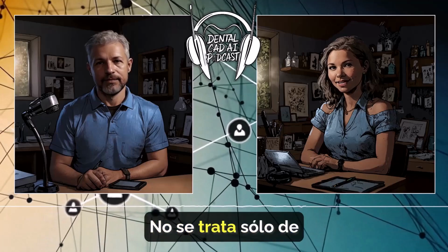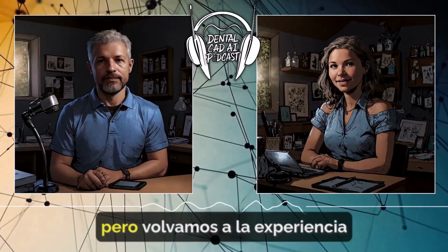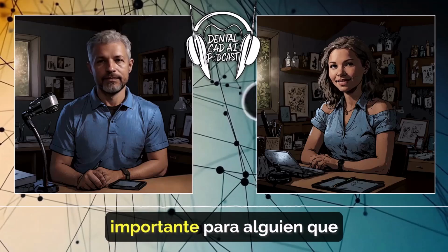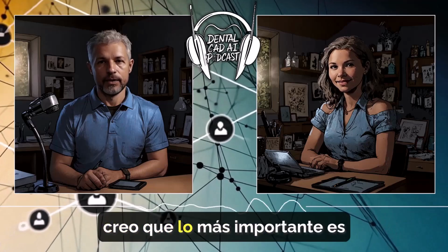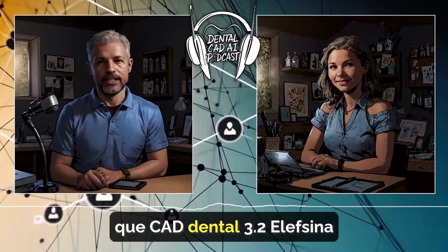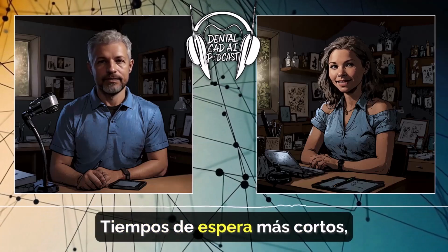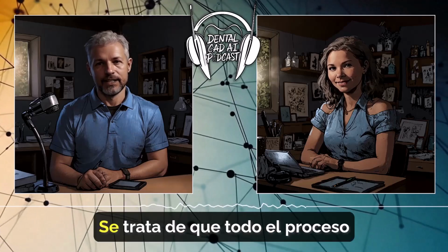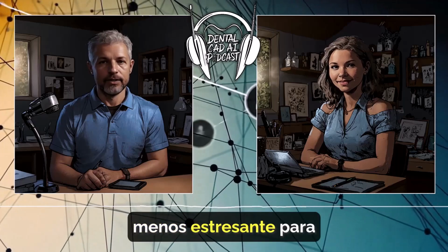That makes sense. It's not just about the technology, it's about using it to enhance communication. Exactly. Okay, but let's bring it back to the patient experience. What do you think is the most significant takeaway for someone sitting in the dentist's chair? From a patient's perspective, I think the biggest takeaway is that DentalCAD 3.2 Elefsina is all about enhancing your experience and improving the quality of your care. So shorter wait times, more personalized treatment, less invasive procedures. Exactly. It's all about making the whole process smoother, more efficient, and ultimately less stressful for the patient.